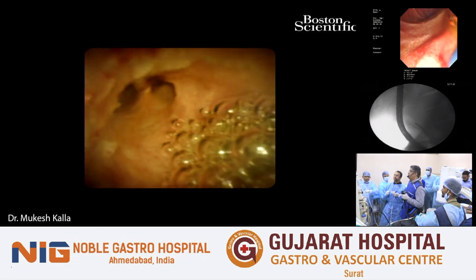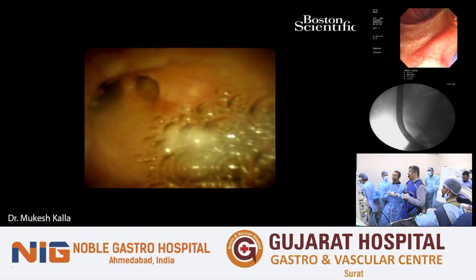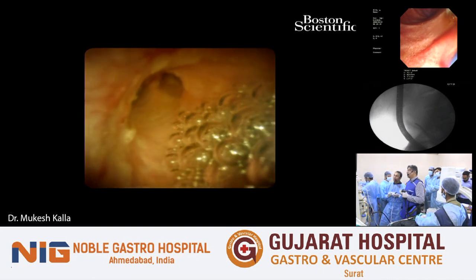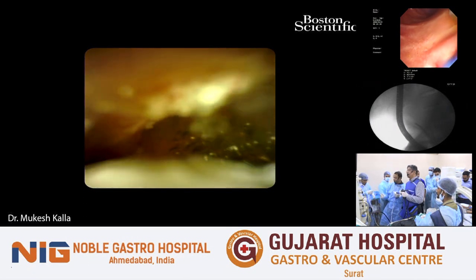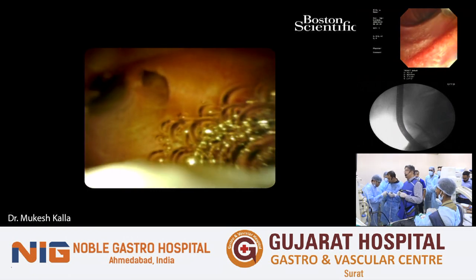Saurabh, we have had a long experience with this cholangioscopy. Now we are heading close to 200 patients. We have always struggled when there wasn't any sphincteroplasty done. Though I am not saying that for small stones or cystic duct small stones, we need to do a sphincteroplasty. Adequate sphincterotomy is good. But yes, if you are dealing with a large stone, which is like 2.5 centimeters and all, I always do sphincteroplasty for, as I said earlier, two good reasons.